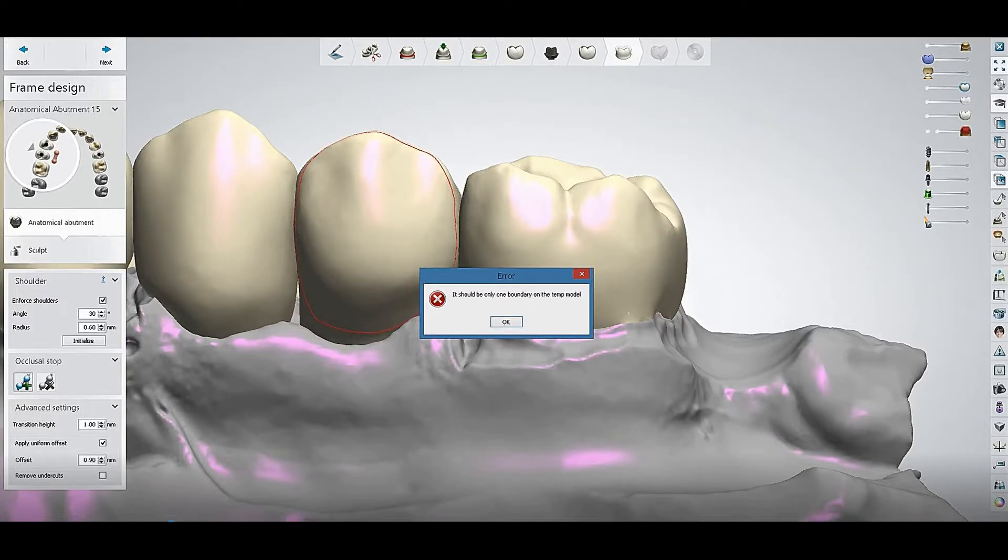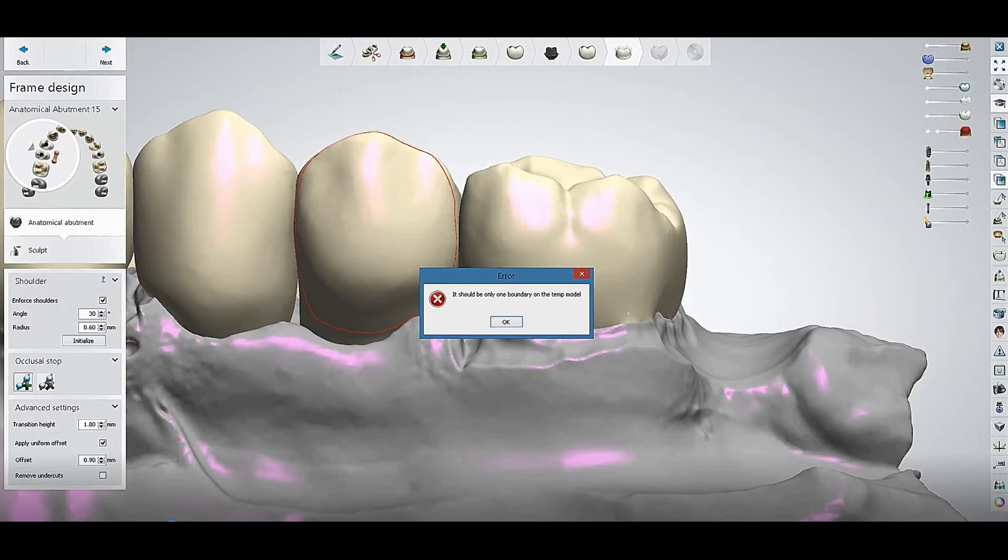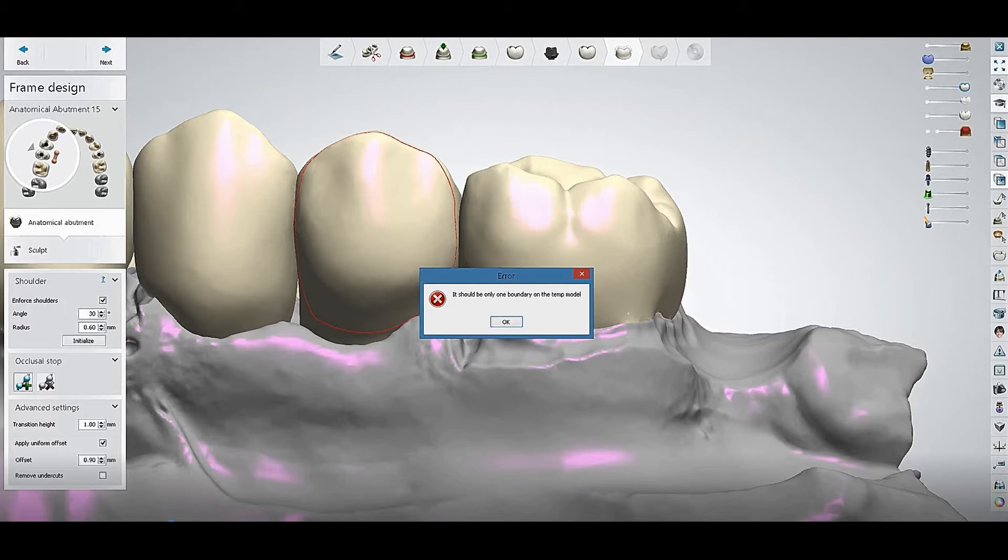Welcome to Digital Dental Technology Solution. Today I will show you how you can solve a common error that sometimes happens when you are going to make cutback or abutment design with the implant crowns. A window pops up with an error like 'it should be only one boundary on the temp model.'